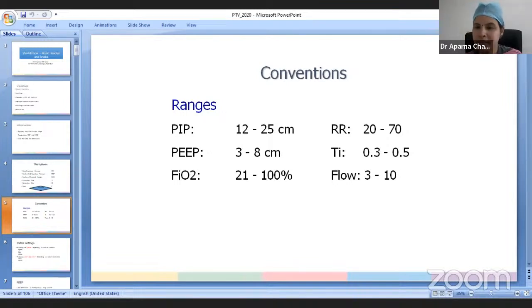So, for example, if we know that we are ventilating a baby with normal lungs, for example, a newborn with apnea, a newborn with shock, or a CNS problem with decreased respiratory drive, we can fairly decide upfront that this baby having normal lungs would probably be okay with a PEEP of 4 or maybe 5. The I-time would be, again, as we discussed, for a term baby, 0.40 seconds, because this baby's time constant is going to be normal. For a preterm baby, around 0.35 seconds.